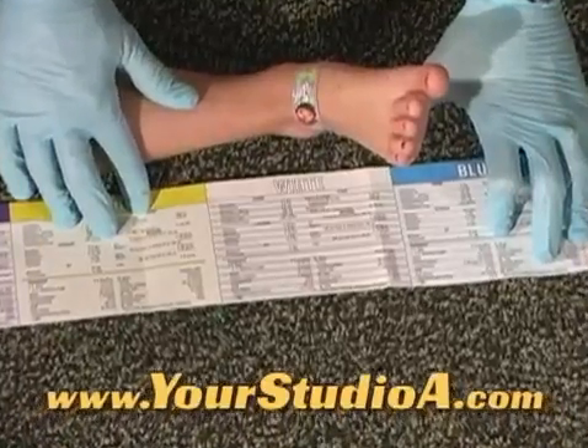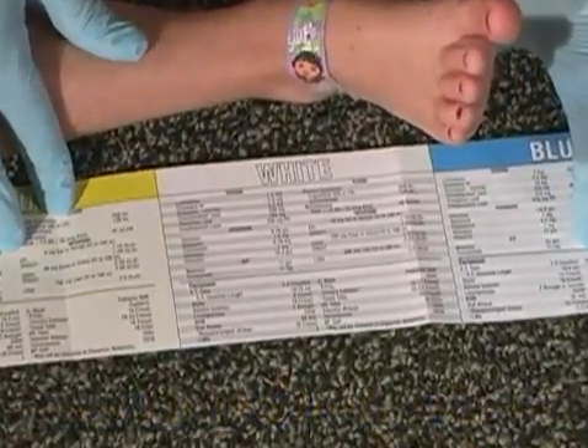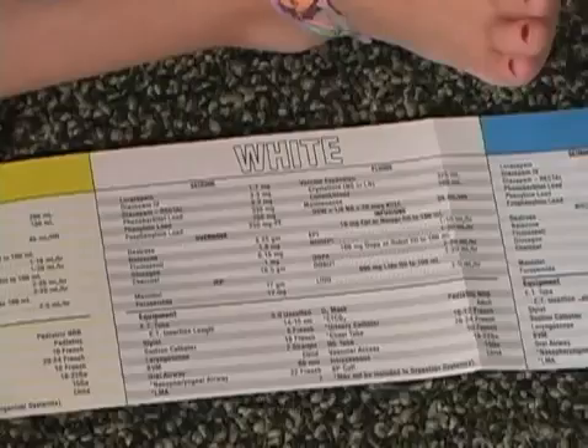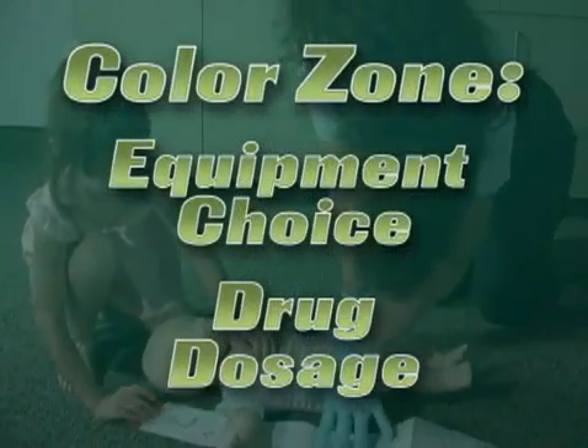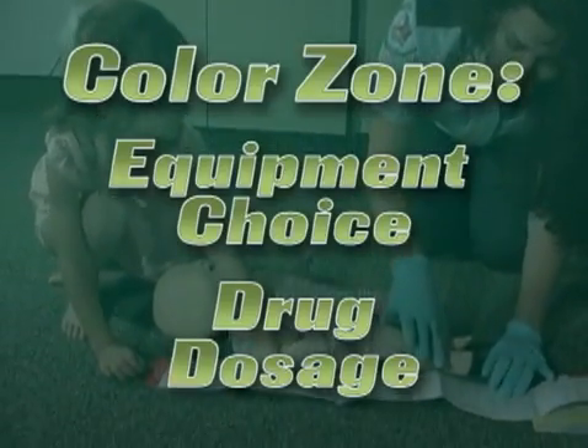The section of the Broselow Tape at the patient's heels indicates the patient's approximate weight in kilograms and the patient's color zone. Use the information found in this color zone to make the correct equipment choices and obtain drug dosage information.